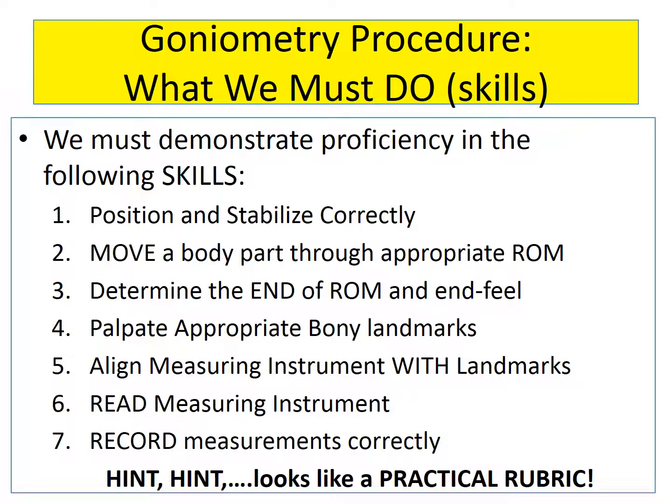In addition to the knowledge that you must know in order to measure goniometry, what are the skills you need to develop? You're going to have to learn how to stabilize the joint of your patient correctly so that you can get an accurate measurement. You're going to have to learn how to handle and move the body through the appropriate range of motion, as well as maintaining the alignment of your goniometer while you are moving the patient passively.